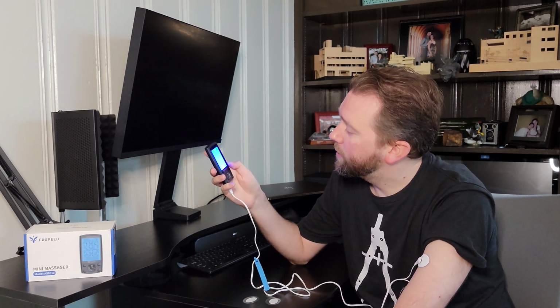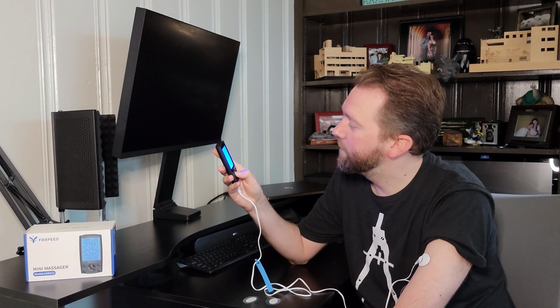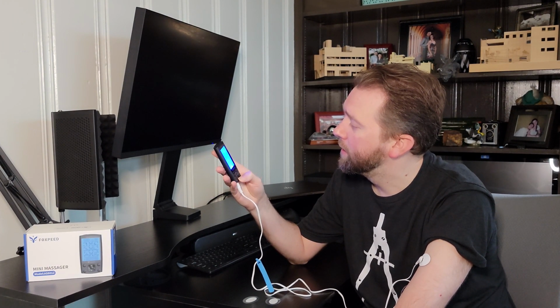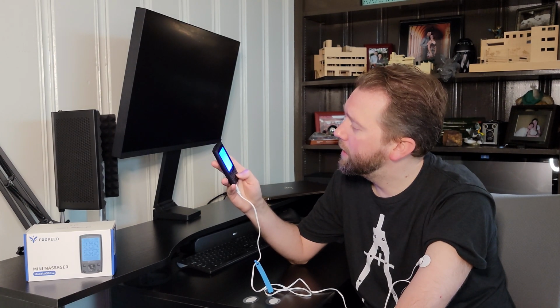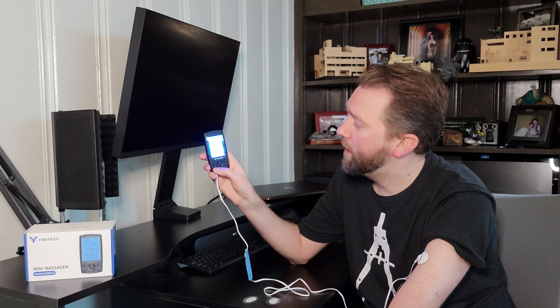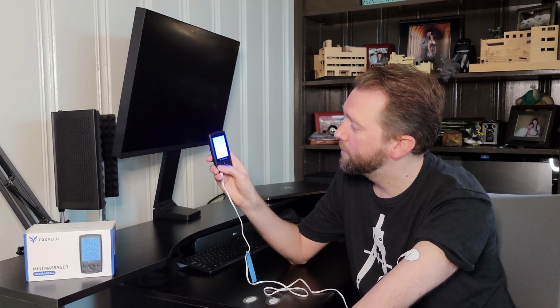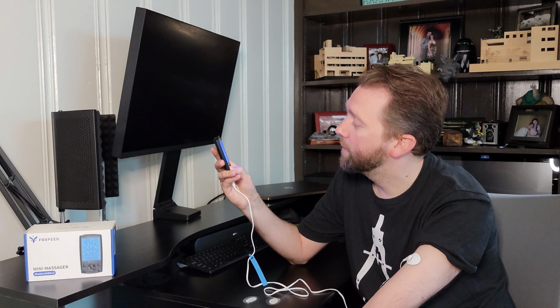And then you're going to go through, we'll cycle through and get our mode. So we'll go down and get a massage here. And the time's good, and we'll go to option number 22. And then you just press the little plus button on the channel you're on. And I can feel it right now. So the one I'm on now is a pulsating feeling, and it goes up and then stops, and then pulsates some more, and then a slow motion. So that's it.